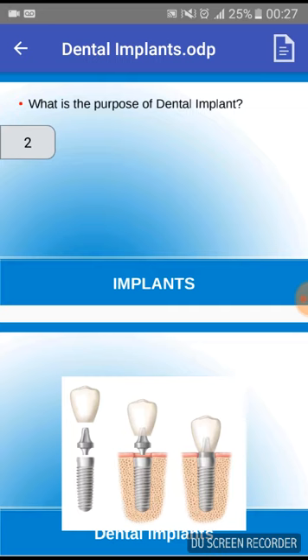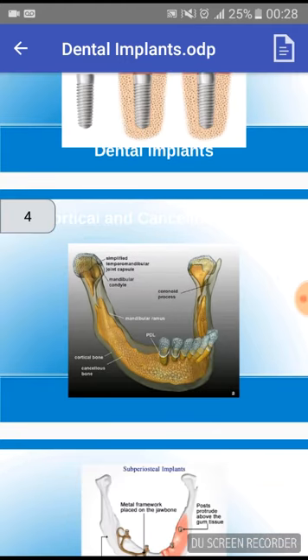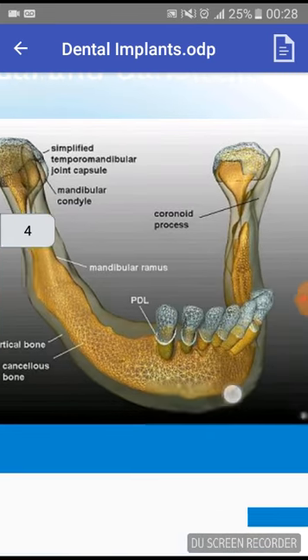So implants themselves can be classified via designs and where they're placed as well. So endosteal implants, the device is placed in alveolar bone, and it only transects one cortical plate. Now the question is, do you remember what cortical plates are? I didn't remember at the point in time of doing this lecture, so I decided to delve into it a little bit better. So let's just zoom in a bit, okay?